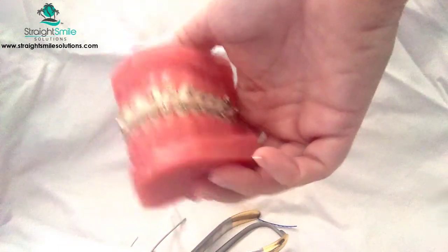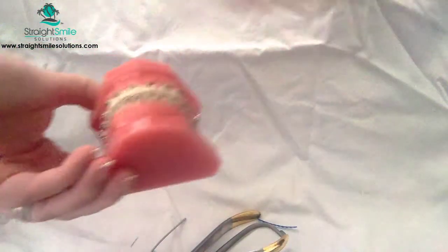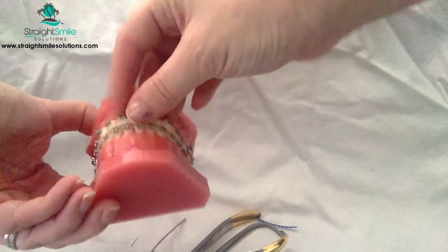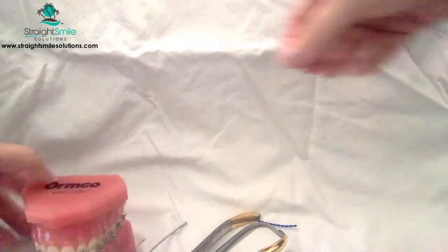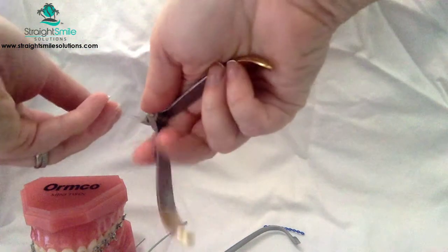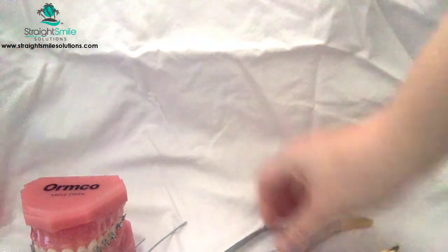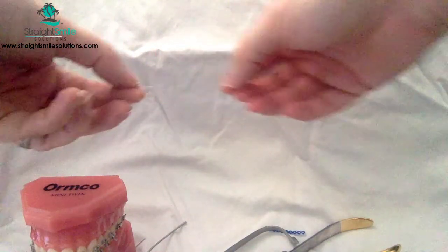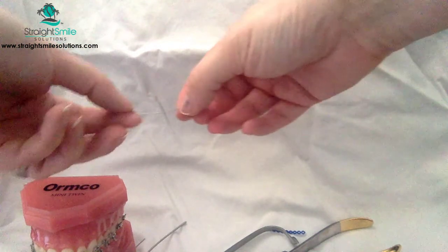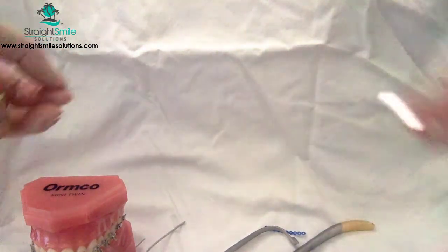So what you're going to want to do is measure what you need. If you have one of those little disposable marking pens, it's great. You can try it in. Let's say we're only going 2 to 2 here, a phase 1 case. I'm going to mark it and clip it a little bit long. This is inaccurate, but you get the idea. I'll try it in, clip it a little bit long, and make sure that when I lay it flat there's about 1 to 2 millimeters left over.